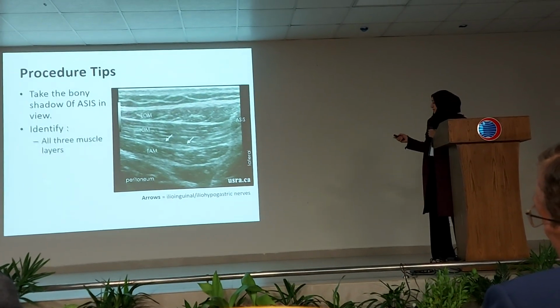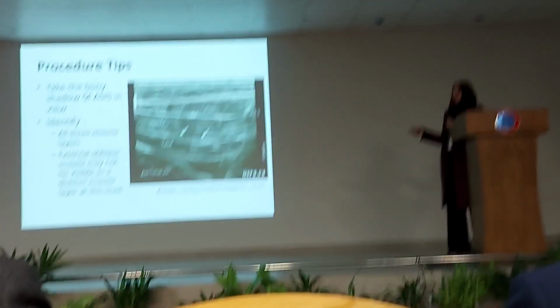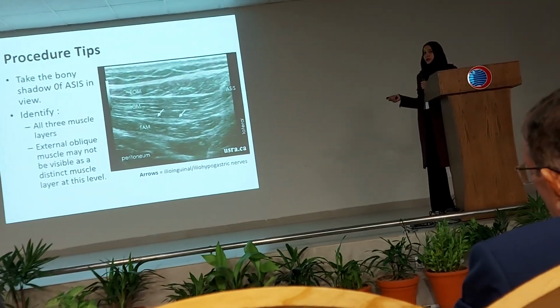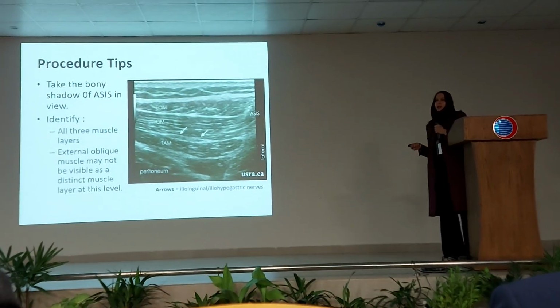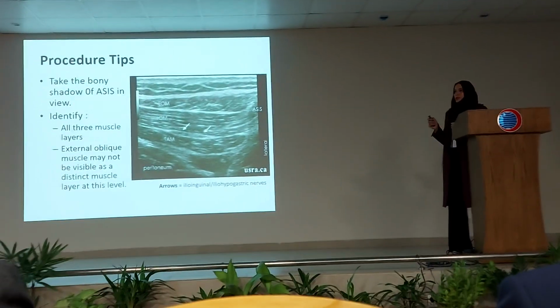And sometimes the external oblique muscle is not present, or just the fascia of the external oblique muscle is not present. So you have to be very careful when you are identifying the muscle layers. Of course, I will demonstrate during our hands-on session how you will start scanning.